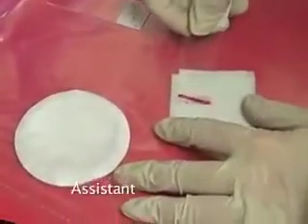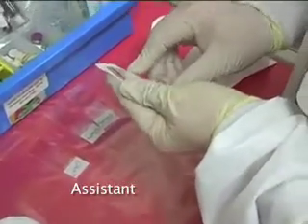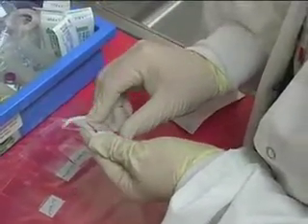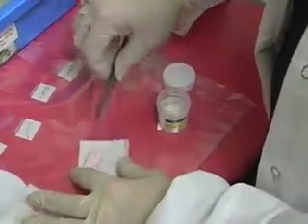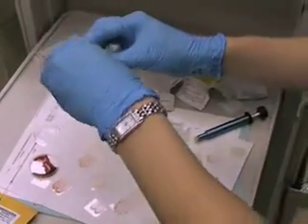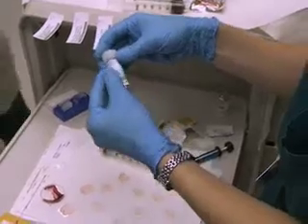The biopsy specimen should be at least 2 centimeters in length in an adult patient. If desired, a touch prep of the biopsy core can be made. The touch prep can allow for morphologic analysis similar to that obtained with an aspirate. After the touch prep, the bone marrow biopsy specimen should be placed in a proper sterile specimen container.